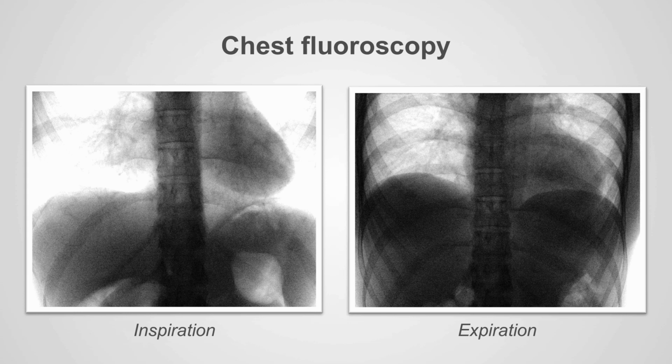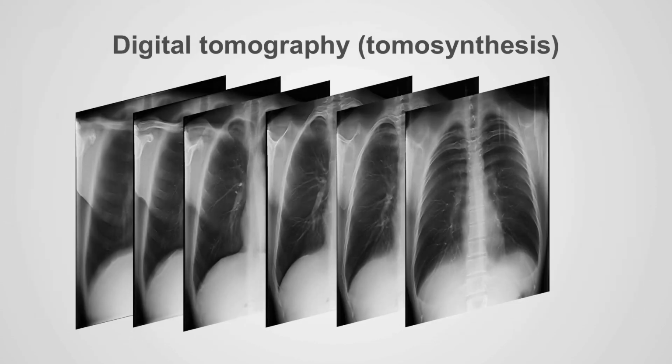Digital tomography is a technology that with post-processing, an X-ray image can be subdivided into various layers very similar to a CT examination, thereby also eliminating the issues of overlap and hiding of structures because of overlap.